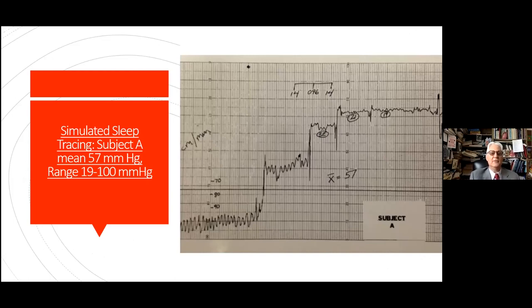Here is a tracing of subject A that had the range of pressure between 19 and 100. You can see that as they moved with their eye upon the pillow, there were just different ramps of pressure. Here's a pressure of 21, here's a pressure of 32. So it depends, as you might expect, on the degree of coupling of the eye with the thing that's causing the compression. If you have full compression, you expect a higher induced intraocular pressure, and if you roll off of it, you have a lower one.